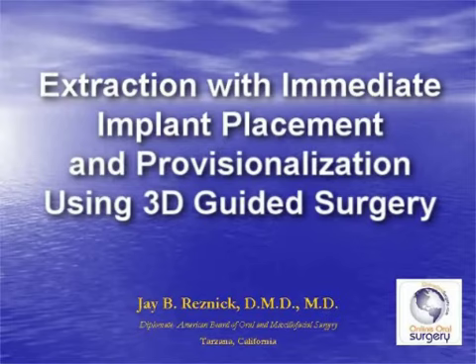In the early 1990s, software was developed that would take the information from the CT scan and allow us to do simulations of our surgery on the screen. And this was a big leap forward as far as being able to do treatment plans. One of the big limitations of this, though, was that it was very difficult to translate the treatment plan on the computer to actual surgery in the patient's mouth.